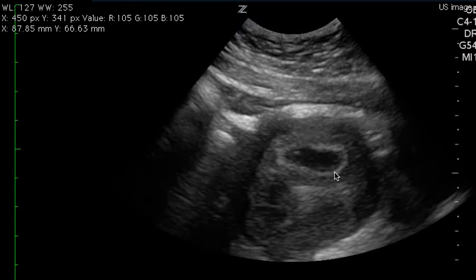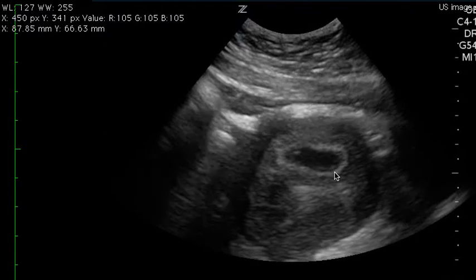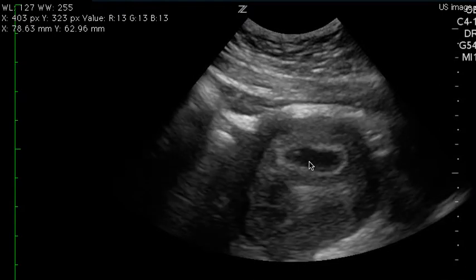This is an OB ultrasound. There is one clip saved, but it's enough for you to see that there is an IUP. If you hold it here, you can see the yolk sac here in the gestational sac. I don't really see a clear heartbeat, but this is all you need to say that there is a positive IUP.